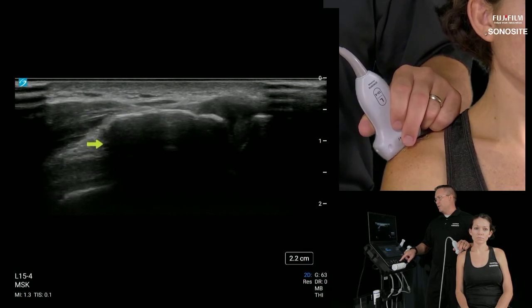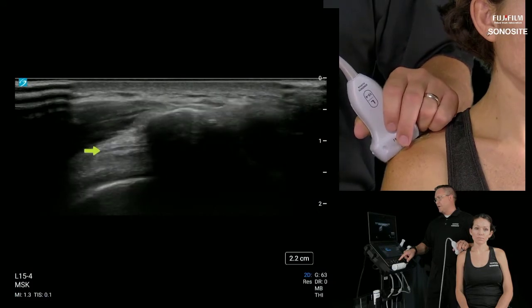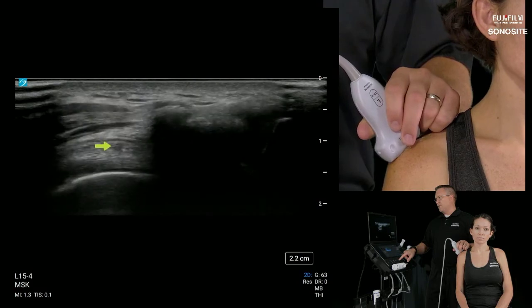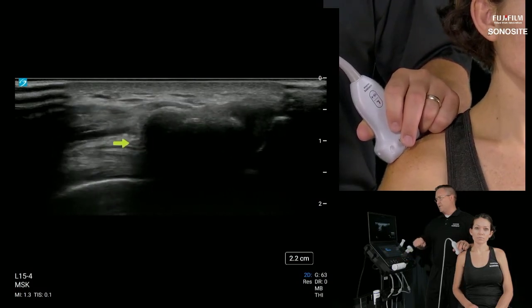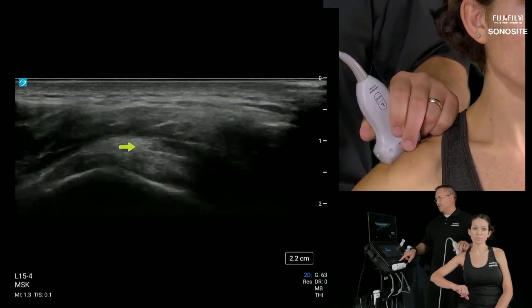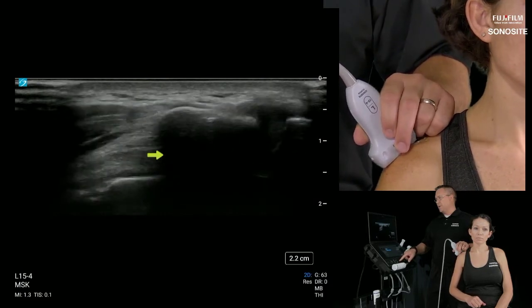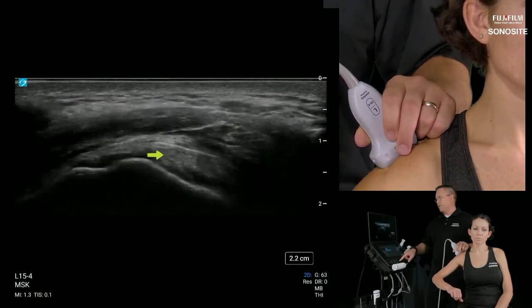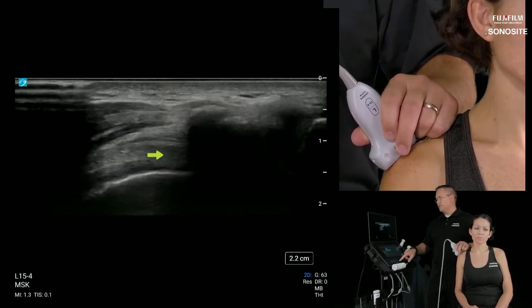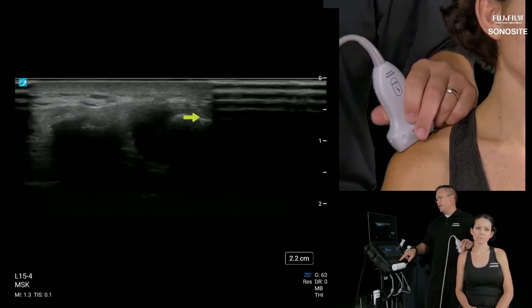So just under the deltoid here, we could see the subacromial space, which was described in the lateral shoulder webinar. So we won't go into too much detail here. But if you wanted to confirm your placement there, we could just have our patient do a slow chicken wing maneuver and then watch that subacromial space glide really nicely. Here's also a good time to see if that's contributing to any clicking or popping around the AC joint. That way you can modify or tailor your exam to also include that subacromial space. So go ahead and relax. There we go.